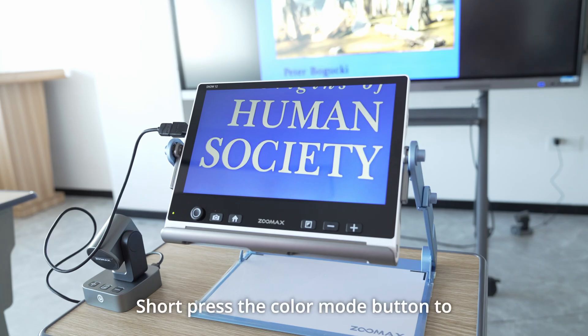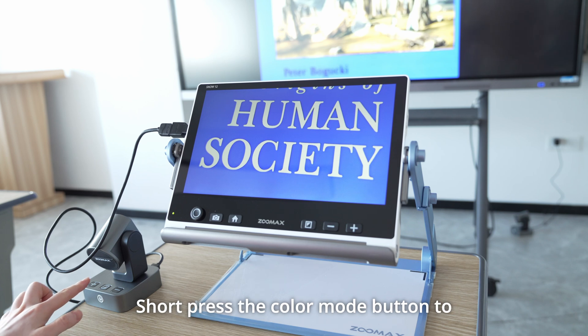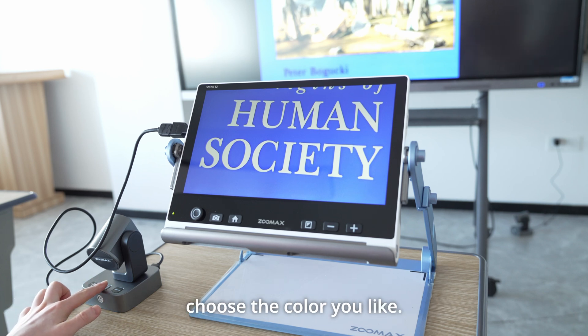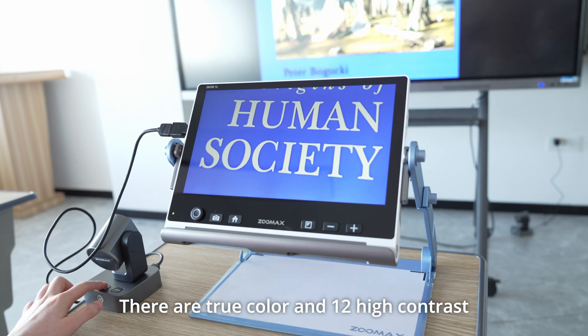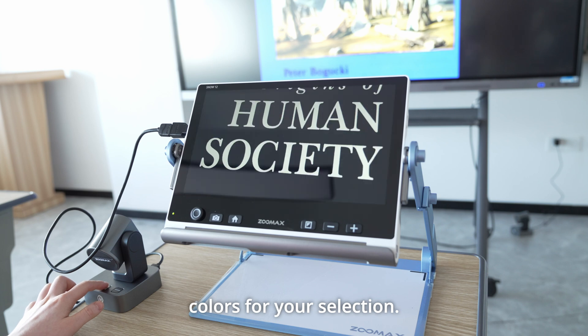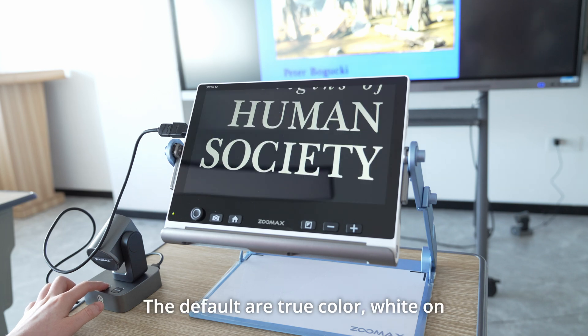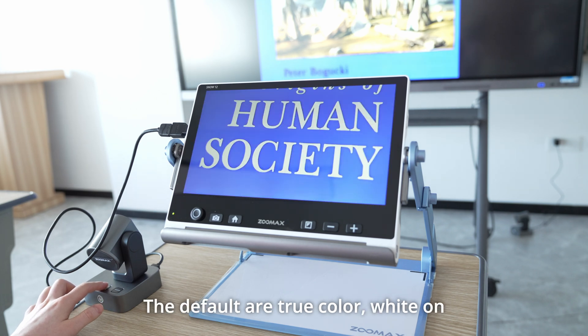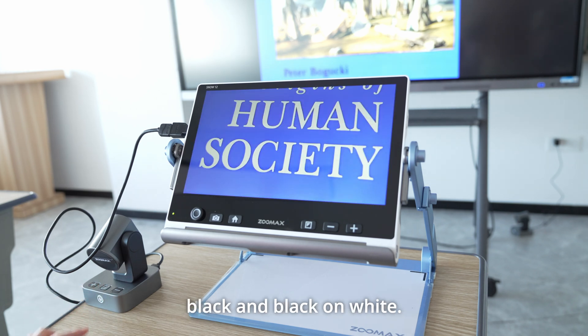Short press the color mode button to choose the color you like. There are true color and 12 high contrast colors for your selection. The default are true color, white on black, and black on white.